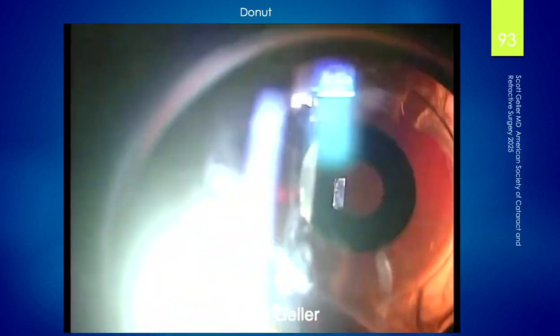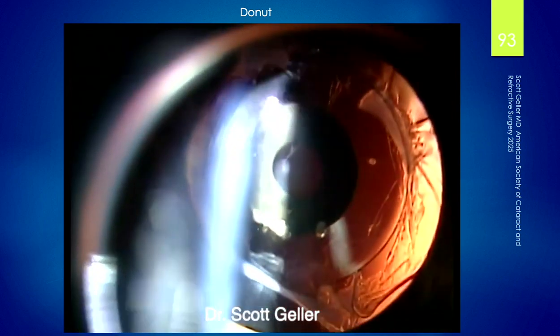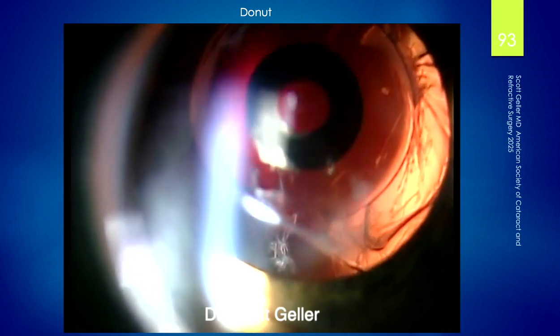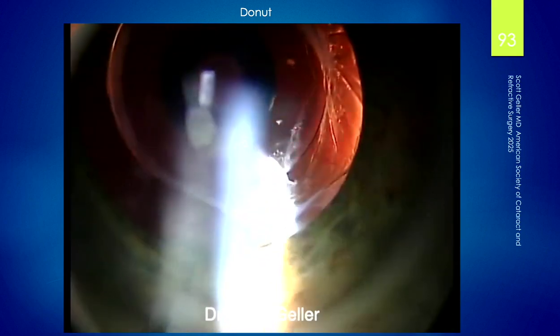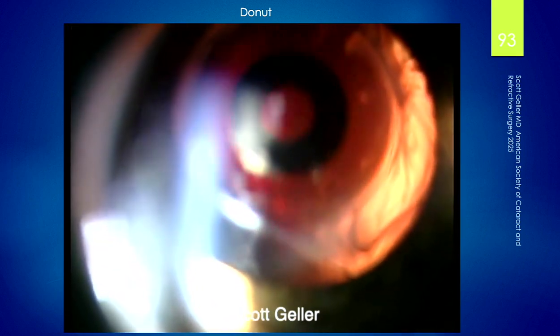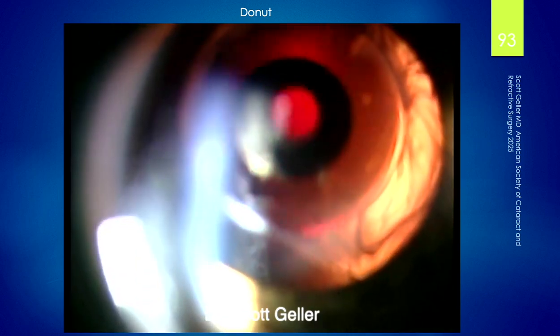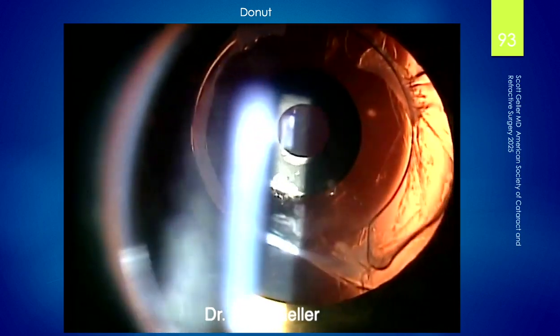There it is. Okay. At this point, I decided, well, maybe we need to do a little enlarging of the capsulotomy, which I did. I asked him if he had a lot of glare from this thing, and he mentioned yes, he did. So we enlarged the capsulotomy so I could get the opacity in that empty space. And it was a little tough. I've used several different contact glasses with this. There we go. We're behind the capsulotomy there in the space, and I'm just cutting the supporting strands.